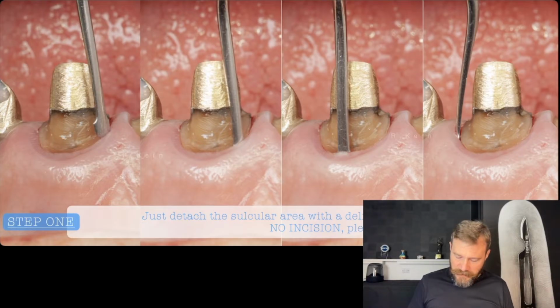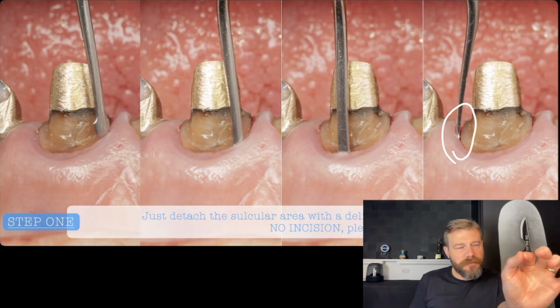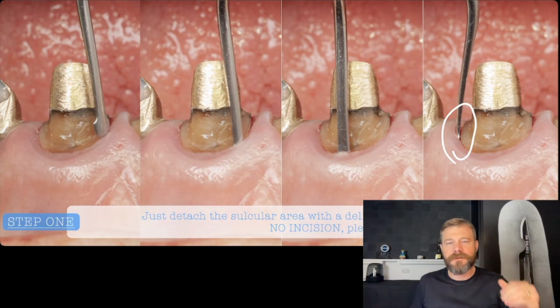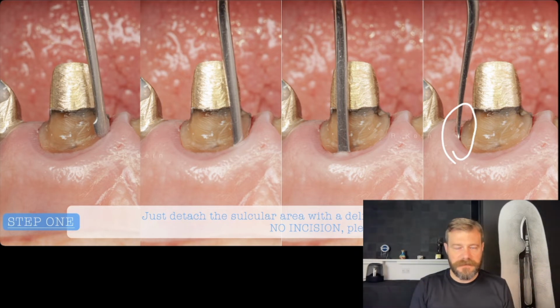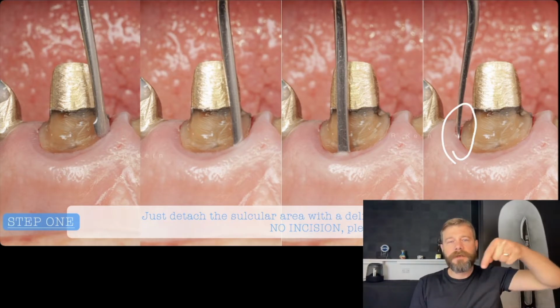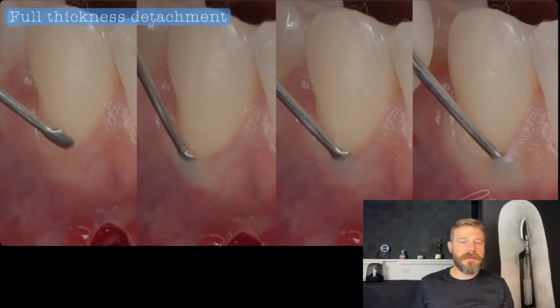If you look here at the lateral profile view of this instrument, you see that it is so thin, so delicate, that it can reach inside the sulcular area, really detaching the whole structure without cutting it. So it's not necessary and not advised for me to use a blade to do this job, okay? So we start bringing this instrument inside the sulcus, and you're going to detach this tissue all around, going to the interproximal area with this very tiny, delicate instrument.